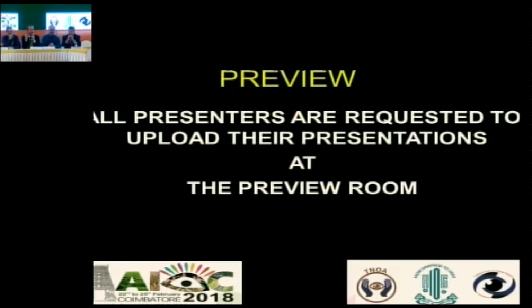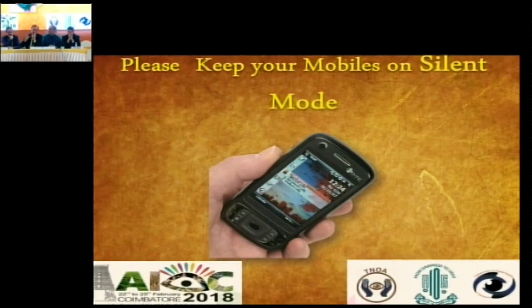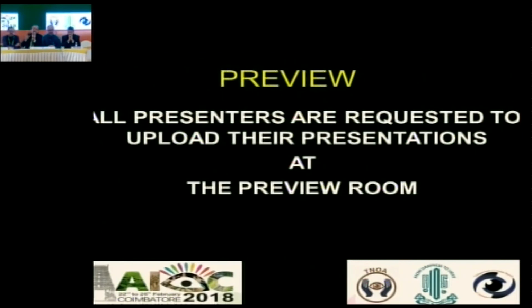A couple of cases I have done, and I got very good results with the anterior YAG capsulotomy. The setting should be about 1.2 millijoules. The access to a YAG laser is not always there, so that is the main problem. A still simpler technique to tackle these cases: the most important thing is that we should not use the 26 gauge needle to puncture the capsule.